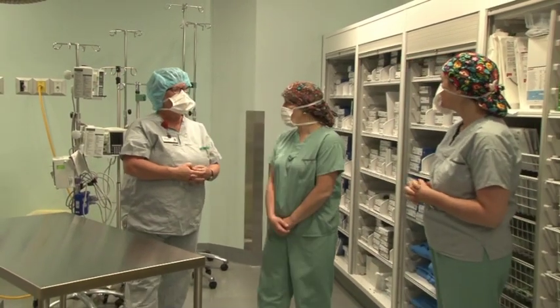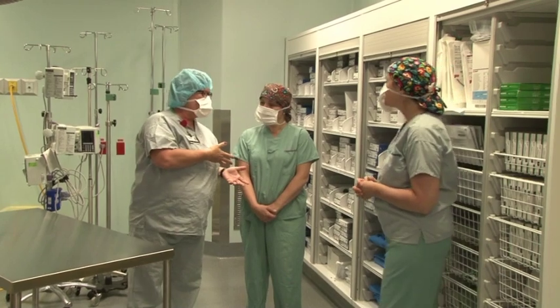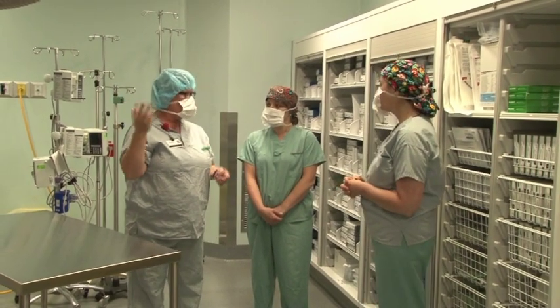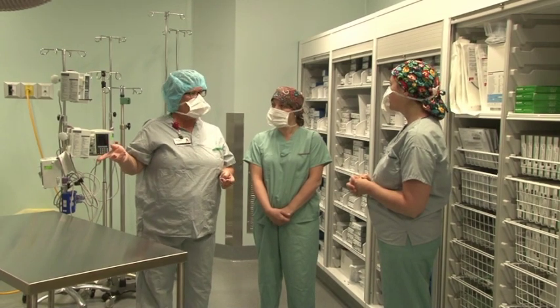So, Jane, I'm just curious, if Brandy and I were working a night shift out on 5A North and we had to put in a temporary pacemaker, would we bring the patient in here? Yes, you would.